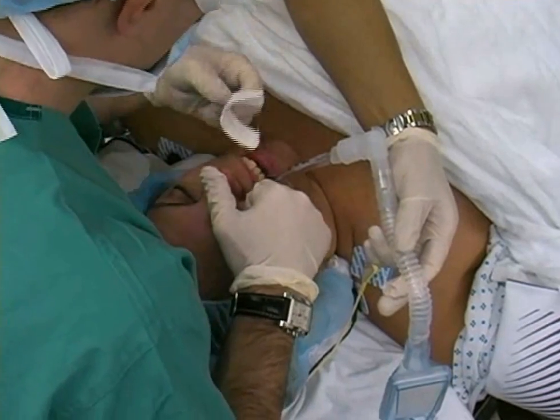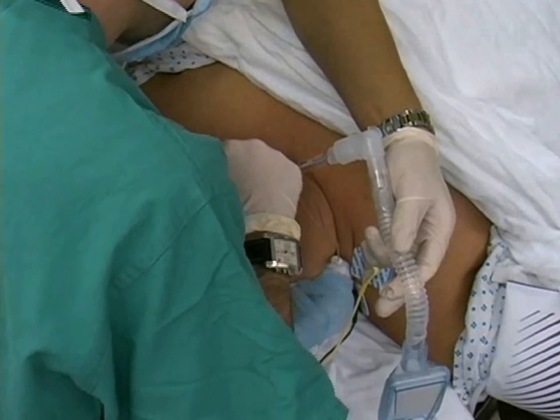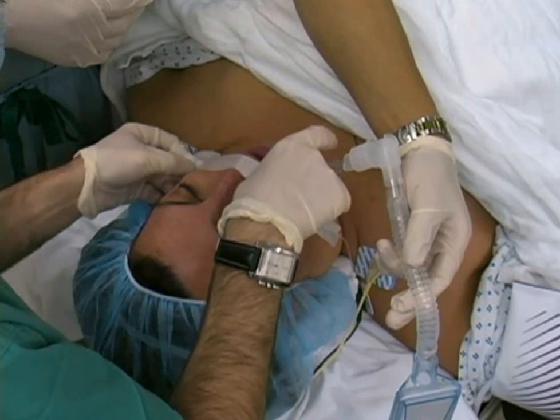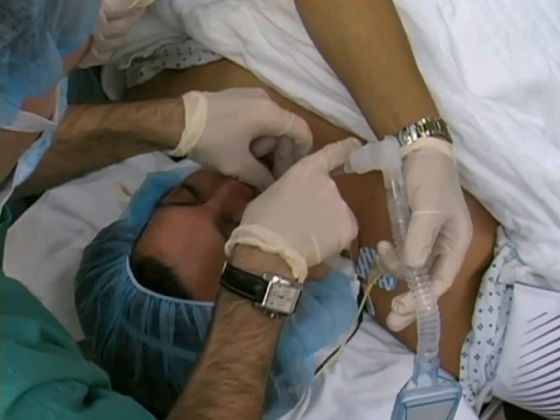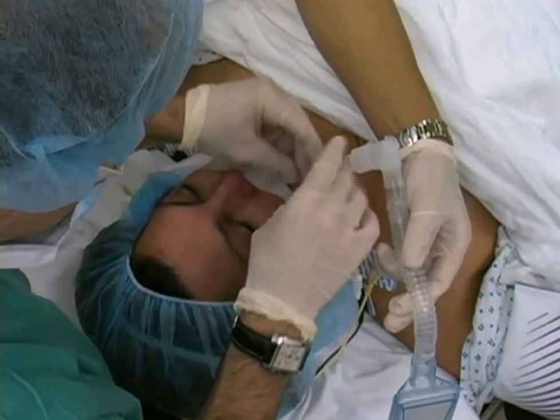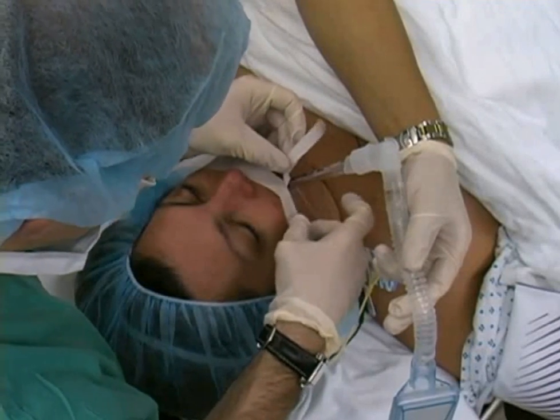Remove the dental guard and inspect the teeth for incidental damage. Secure the tube with tape. Fix the tape to the patient's cheek and upper lip around the endotracheal tube and again to the upper lip and opposite cheek.